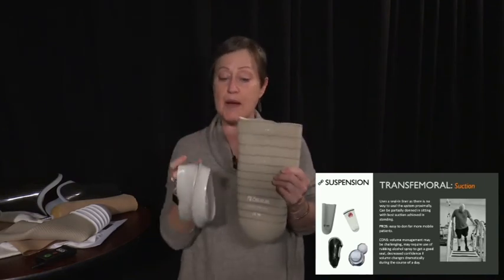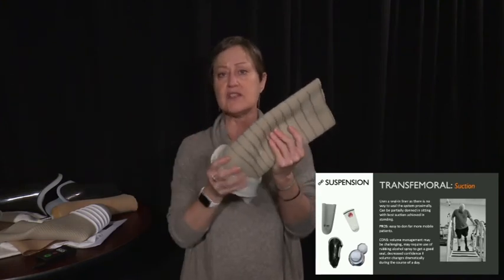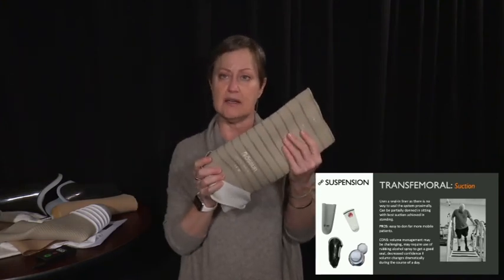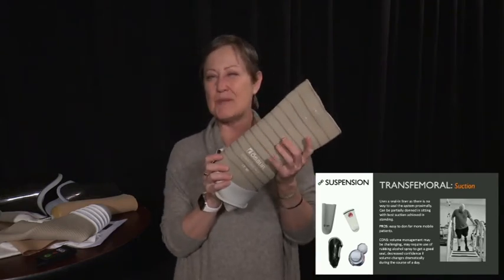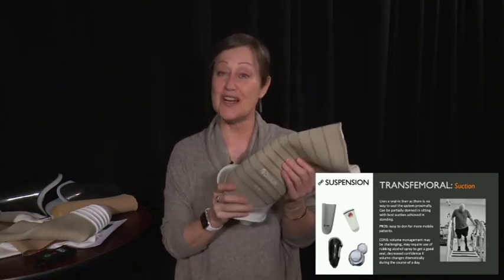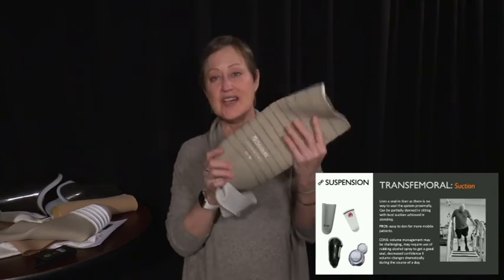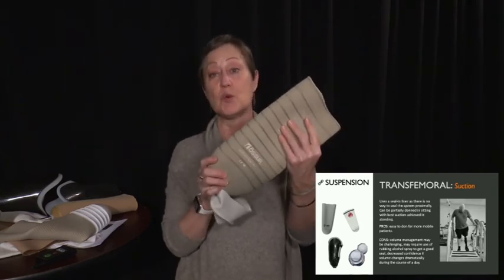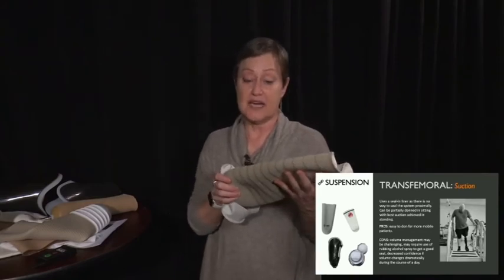It's going to gap a little bit. You can't stop that. So this is usually you're going to see this on a higher level patient, and they need to be a little bit more stable in their limb volume. When they shrink, they lose suction, and they need to add socks, but losing suction can be a real problem, more so for the transfem patient, I think, than for the trans tib patient.